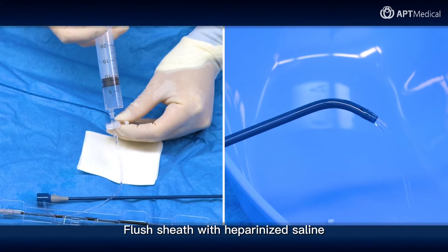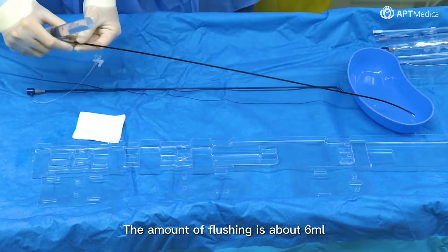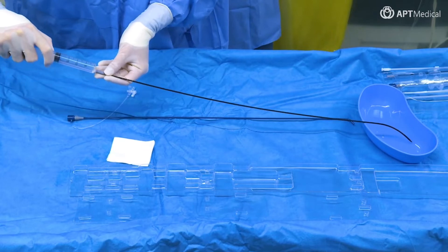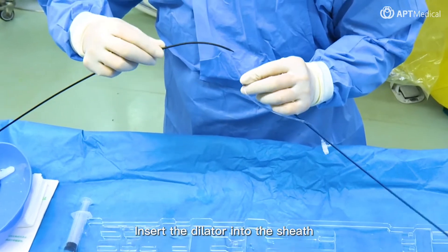Flush the sheath with heparinized saline. The amount of flushing is about 6 milliliters. Now flush the dilator. Insert the dilator into the sheath.